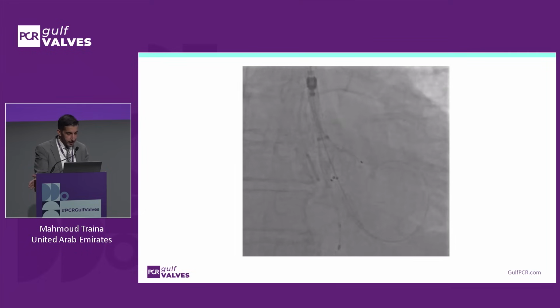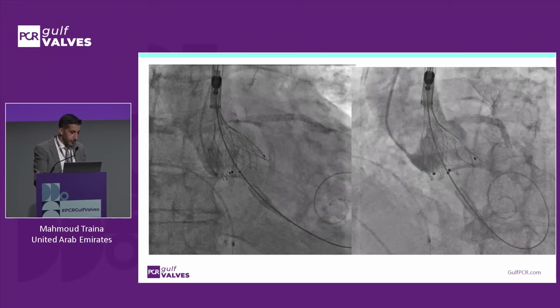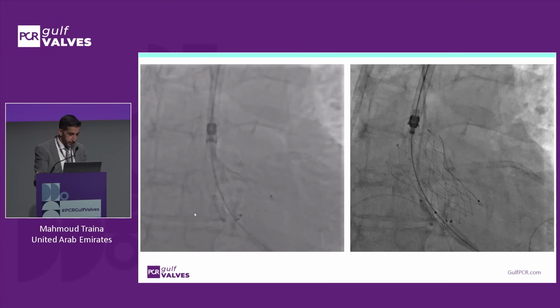Commissural alignment's maintained, so we do this in the cusp overlap, so you can see the two dots on the left of the screen and one on the right. We verified our positioning here. So this was what Dr. Muhammad was talking about, hugging the lesser curvature, so not the greater curvature, but we figured when we released, it will pop up on the left side because it was a little deep on the left side there. And this is showing the release, just nice and stable.